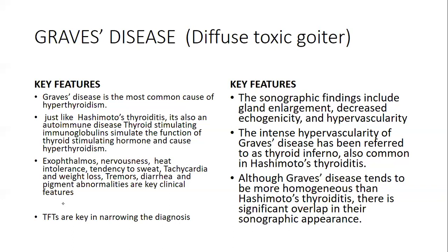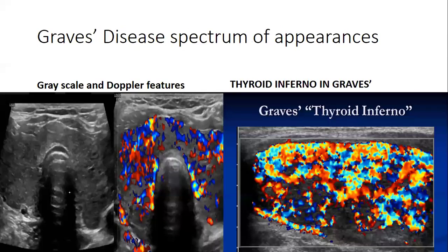So you need to complement the sonographic evaluation results with the lab results so that you narrow the diagnosis. Otherwise, if you only depend on ultrasound, you may have a diagnostic conundrum. So maybe there is need to involve the other stakeholders. So this is usually the appearance.